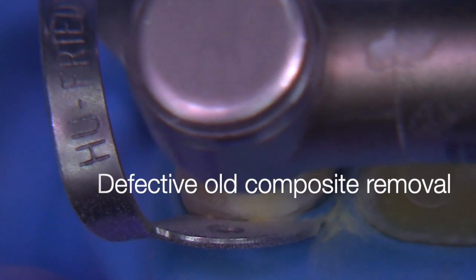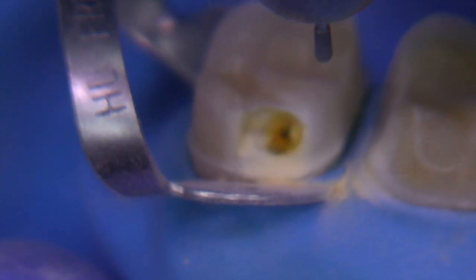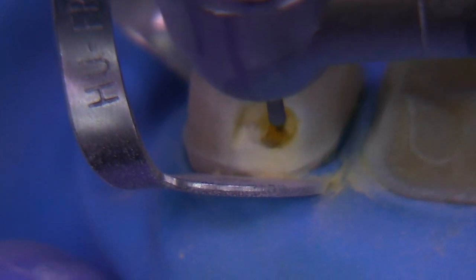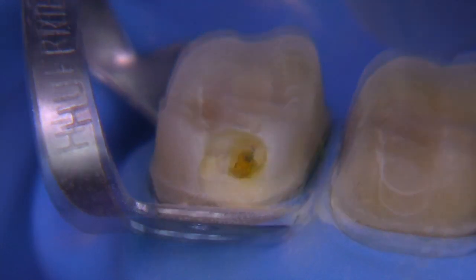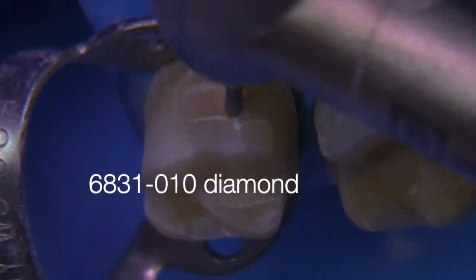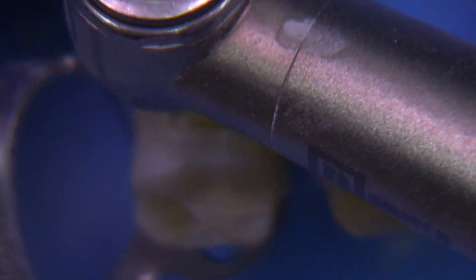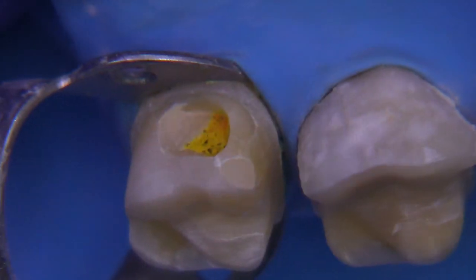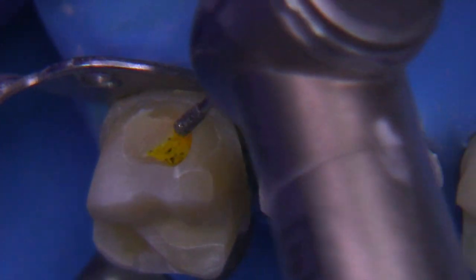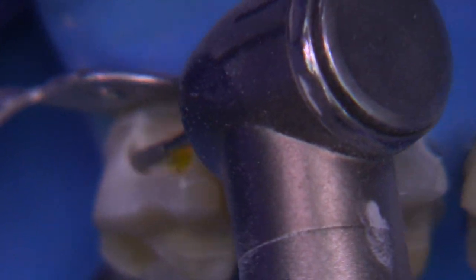I'm going to utilize a burr I really like that's shaped like a 331 burr but it's diamond and it's a coarse grit — 125 micron grit. This is the 6831. I like to think of this as a wider 330 diamond with a coarse grit that works really rapidly. So we're just removing the caries and I've sped up the video here as well.